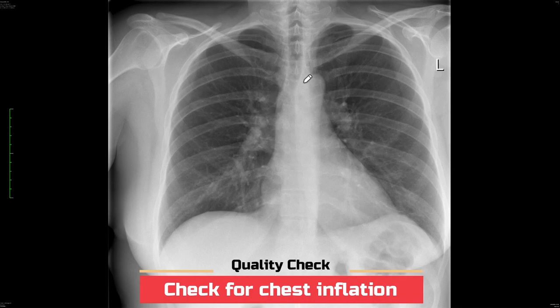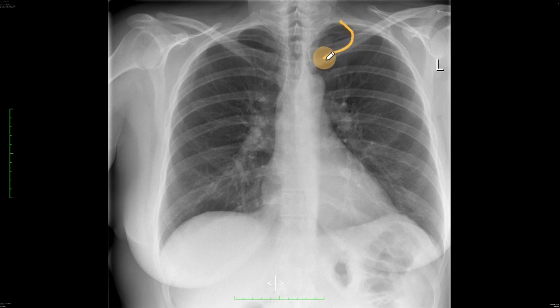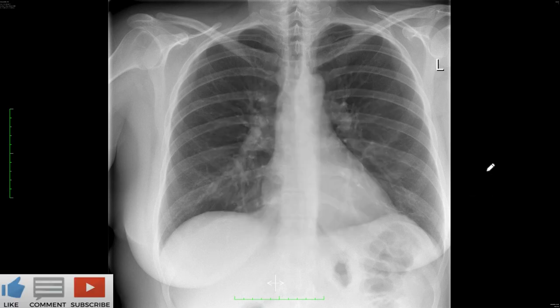The third thing you need to check is to make sure the patient has had adequate inspiration, and the way we do this is by counting the number of ribs. Usually you should count six ribs on the left hand side or intercostal spaces. If this was four or less than five, it means the patient hasn't had good inspiration. This is important to note because it can make certain things look like pathology when they are not.